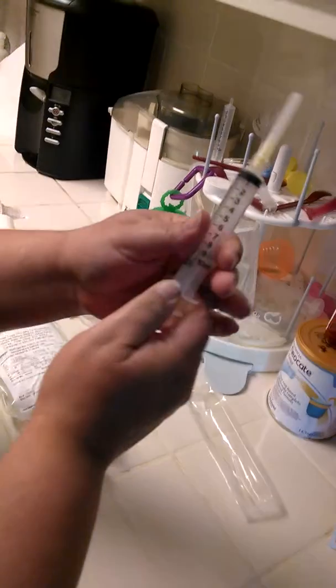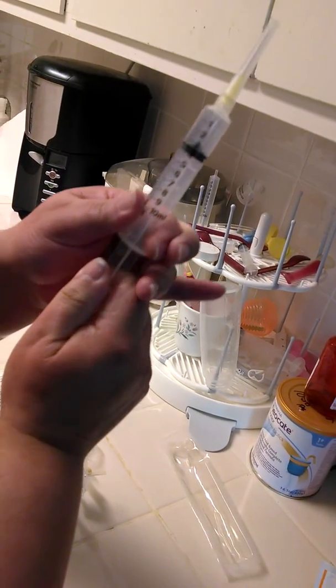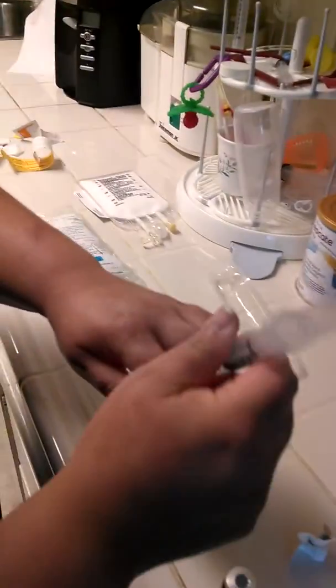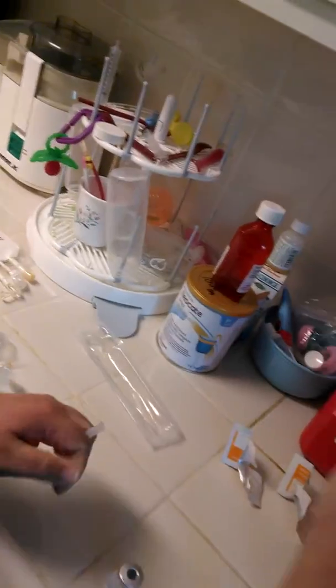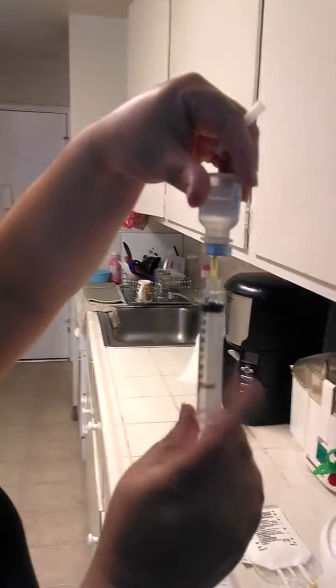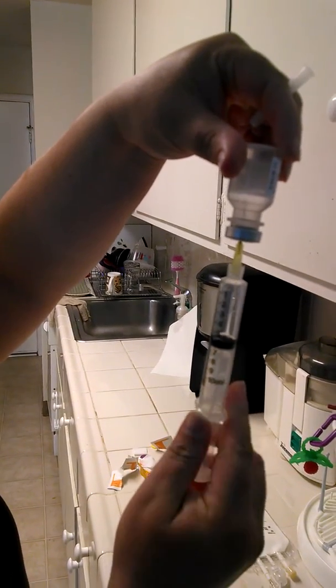Grab your sterile syringe, tighten the needle, break the seal, and add in five mls of air. You're going to be utilizing it between your hands. Uncap, go down and — boom — in the bullseye, flip over and extract.